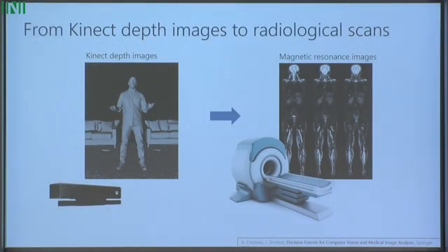So in InnerEye, we're working on similar problems where the input images now are radiological scans, and the output is the segmentation or pixel or voxel-wise classification for various parts of the body.